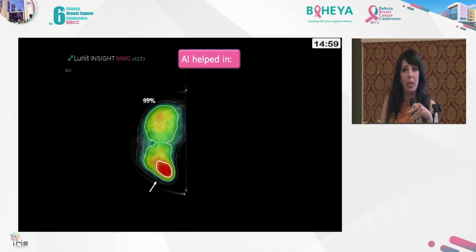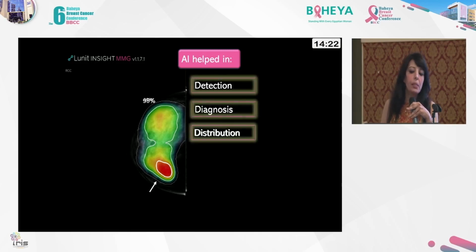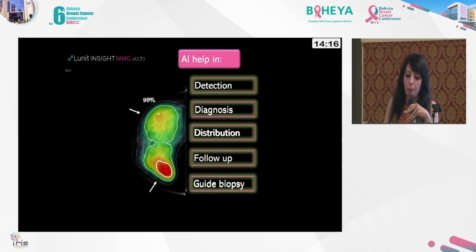But when I go with the heat map, it targets through the intensity of the color where to put my needle, to be definite about whether the upper part of the breast is involved with the DCIS or not, especially since DCIS has skipping lesions, what I call skip lesions. Because if the surgeon removed the lower inner quadrant, they could find a free edge around it. I did my job, but actually there are skip lesions that I couldn't confirm. But when I take the biopsy from the areas of intense color map, I could tell him if there are other lesions or not about the imaging distribution of the lesion. So the AI helped in the detection, yes, in the diagnosis, in the distribution, and this time it guided my needle for the biopsy.